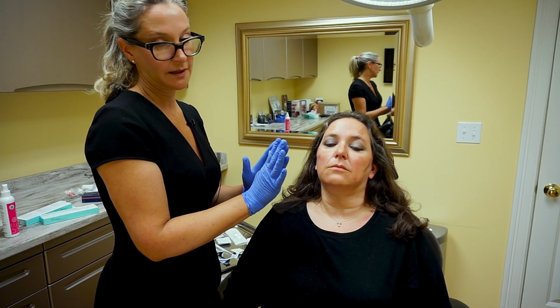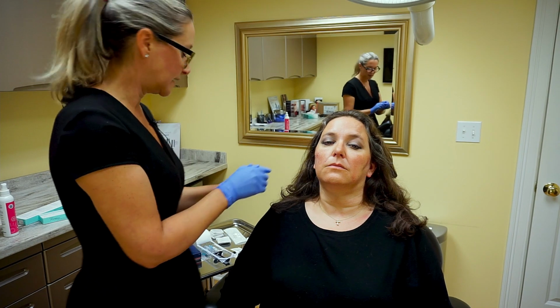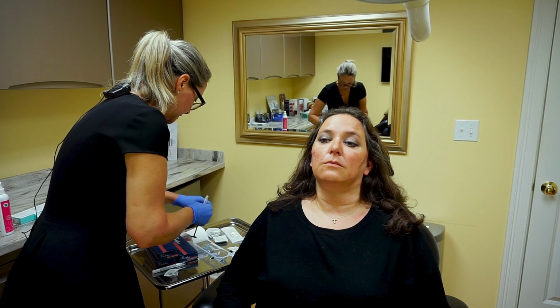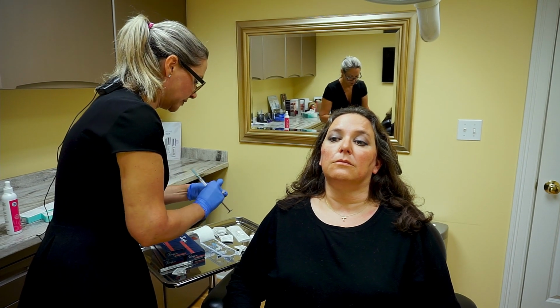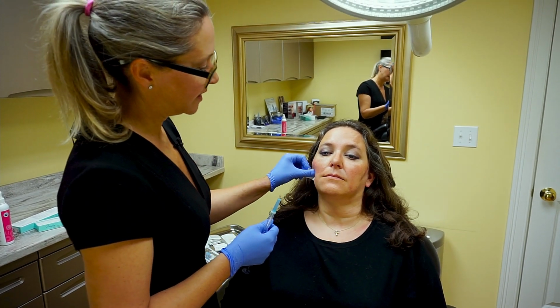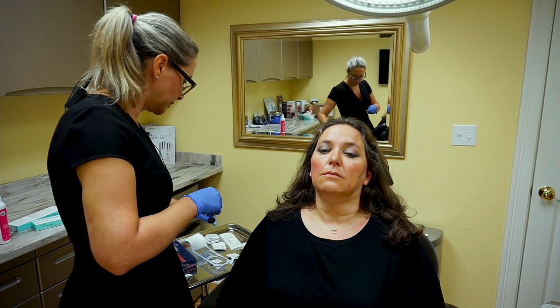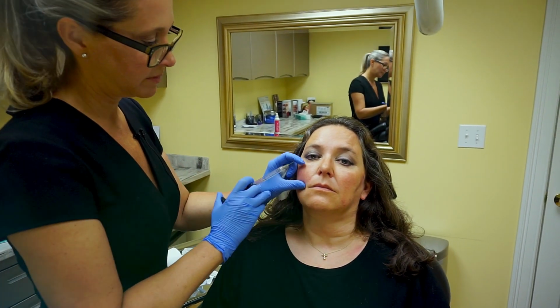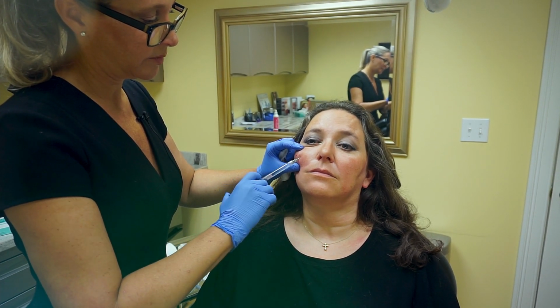Now I'm going to take what I like to think of as my drywall and get in there and really mold in and round out the cheek in the front. And for that, I'm going to use this new Restylane filler called Contour. And that is a little bit more pliable. I could use it a little bit closer up in the dermis here to round it out, and it's going to move with her a little bit better. This filler has been around in Europe for several years, and it's just launched onto the American market.